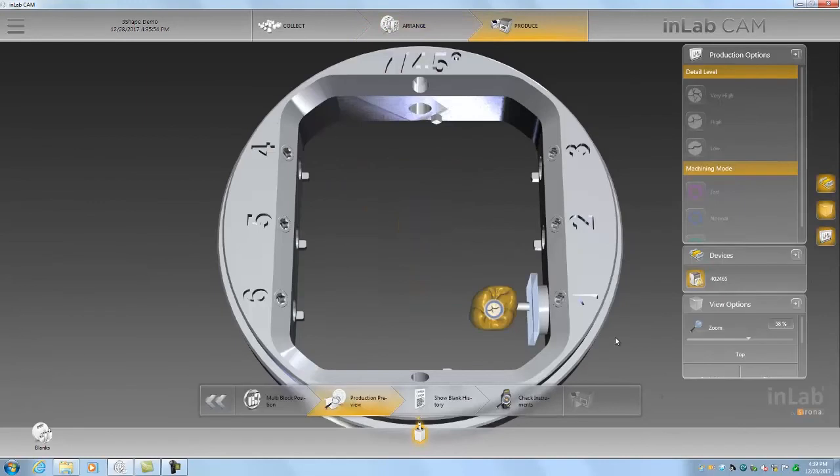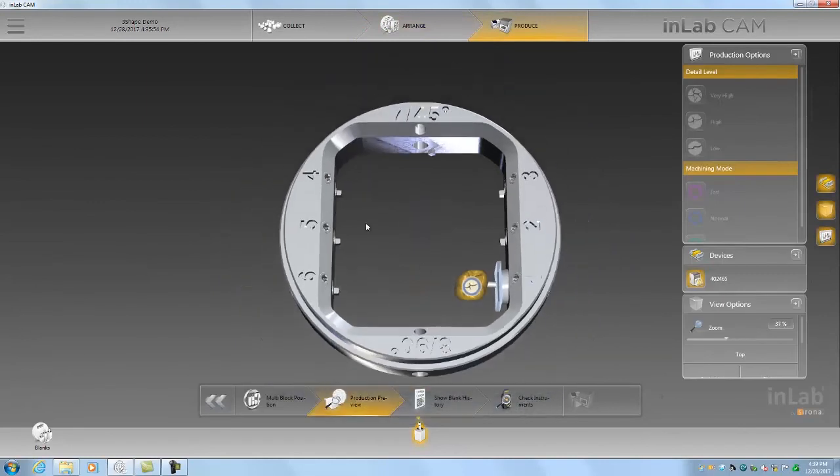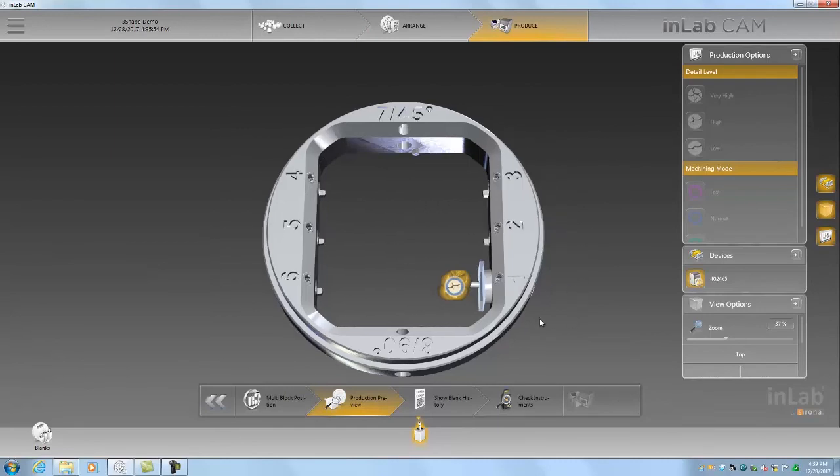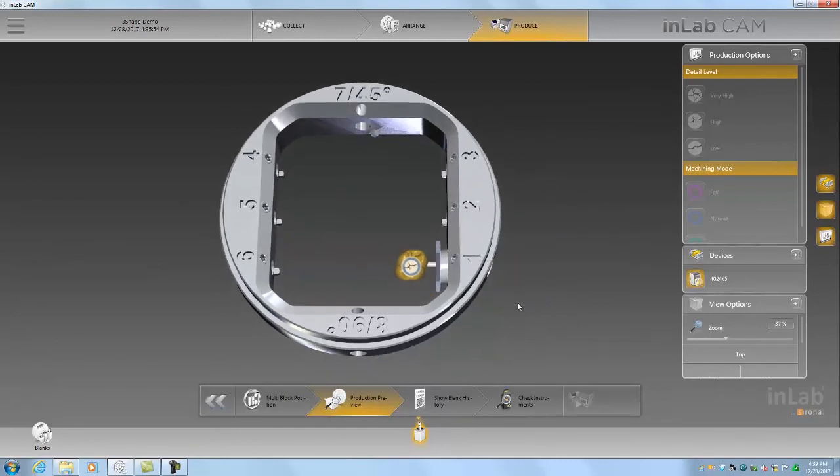And finally we'll be nesting this in the MCX5 blank holder. Right now it defaults to position one, which is fine.